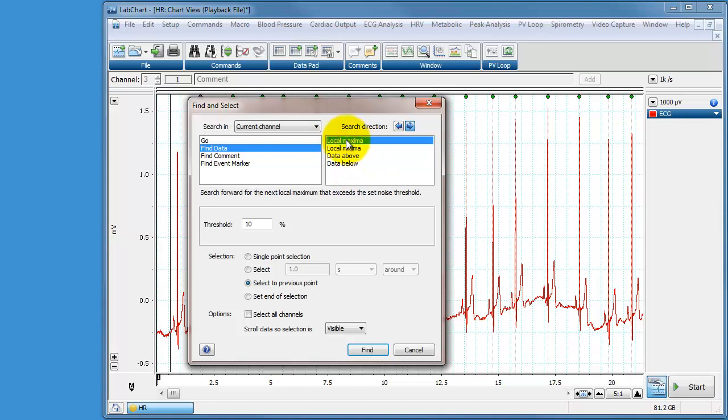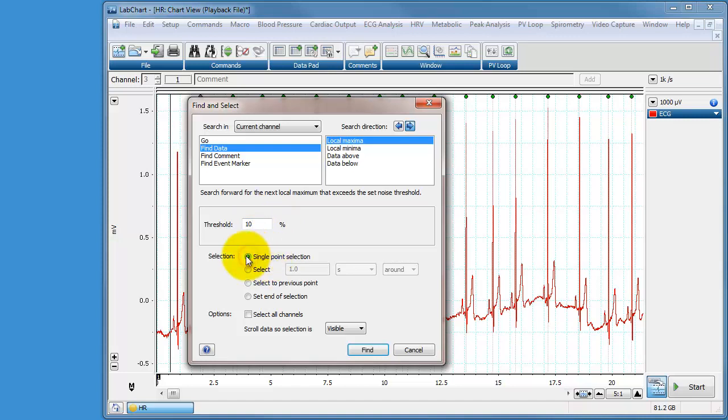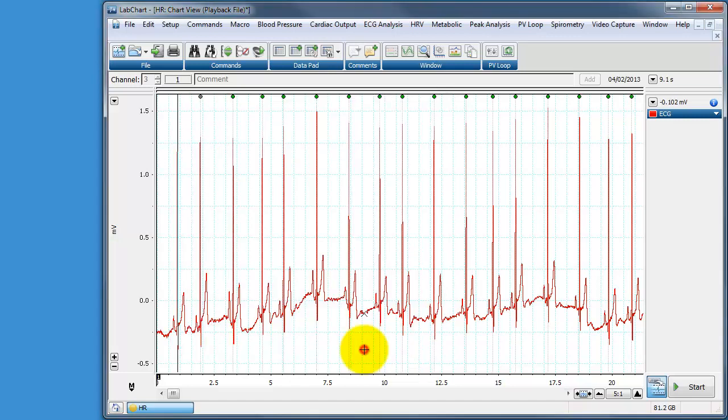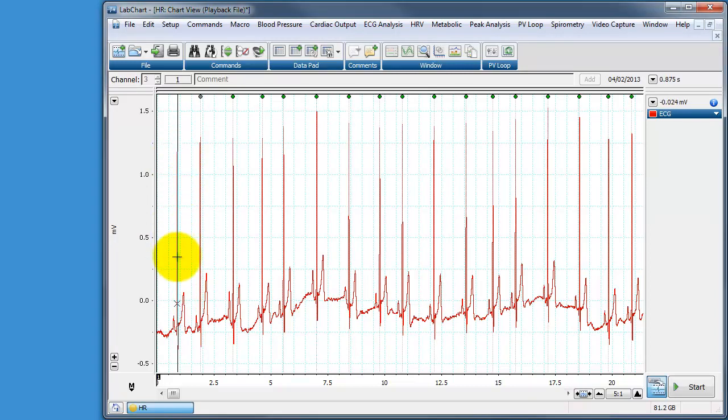I want to look for maxima, in other words peaks, and I've written here a threshold of 10%. I know this works, I could choose 15 maybe or 8 or some other number but I know that 10% work and I can select a single point. So I press find and what the cursor has done is jumped to the first available R wave. You can see this black line indicating the first R wave.